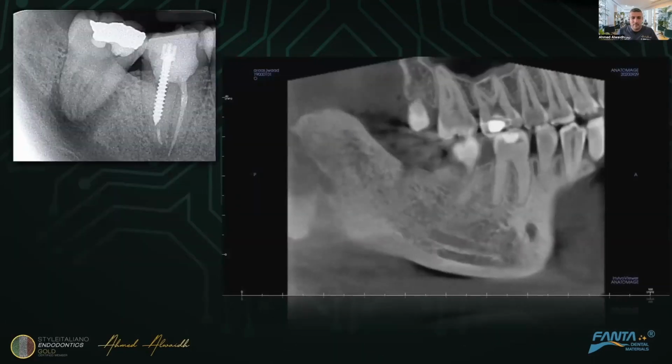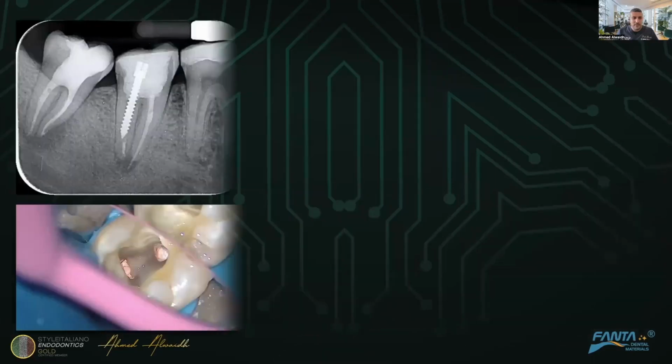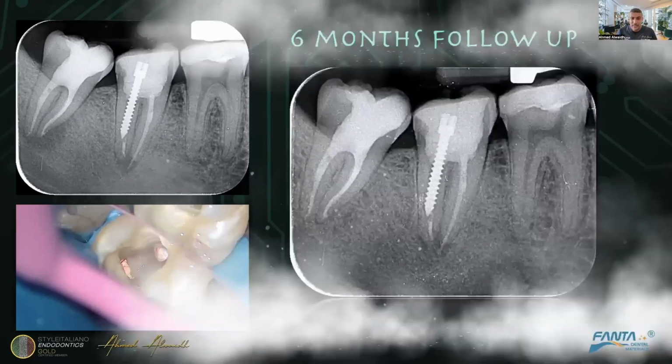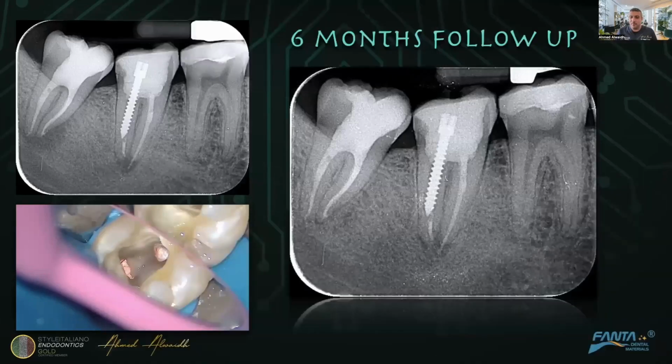Yes, this is the slide. So this is immediately after obturation, okay? And then at 6 months follow-up, we had complete healing. We had complete bone formation. And in this case, I used modified hydraulic obturation, where I used high flow bioceramic cement with heat application.